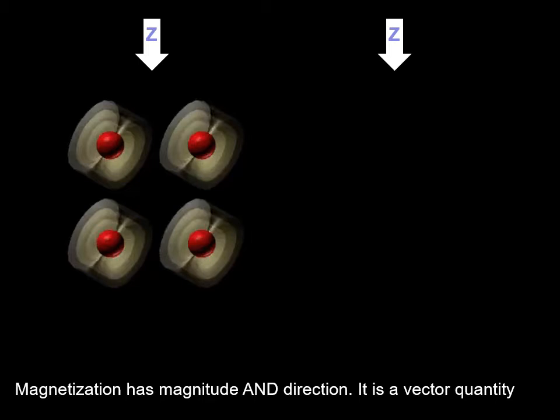Magnetization has magnitude and direction, so it is a vector quantity. When dealing with multiple vectors, vector math must be used, taking into account both the magnitude and the direction of each component vector. In this illustration, the 4 nuclei are shown lined up in the same direction as one another. When they are aligned in such a way, they are said to be in phase, and the overall effect is a straightforward addition of their magnitudes. If they were not aligned with one another, they are said to be out of phase, and their overall effect is less.